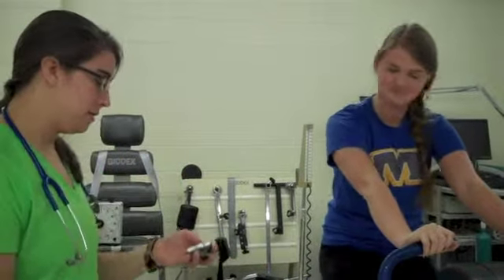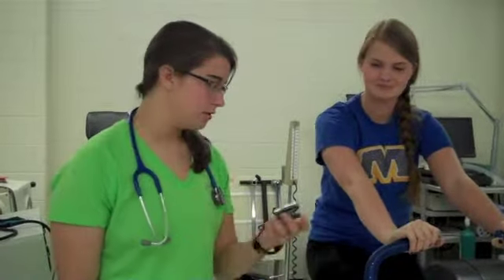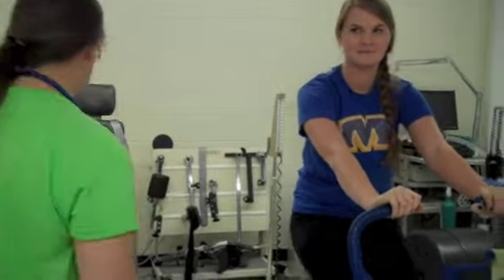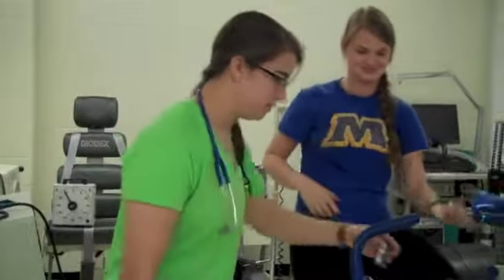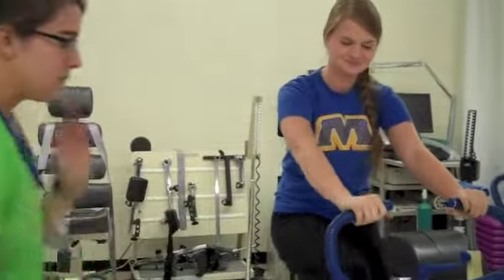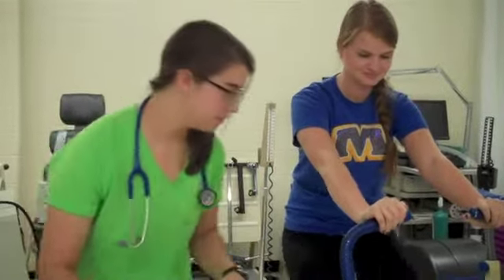Okay, so Ashley's been warming up now for about 2 to 3 minutes, so we're going to start administering the test. Ashley, I'm going to start the metronome at 100 BPMs, so try to keep your stride with that. Can you hear that? I think you can clip it right here. Where do you want to clip this? We'll clip that bad boy right there. Alright, so now we are going to start the test at 0.5 kilograms.